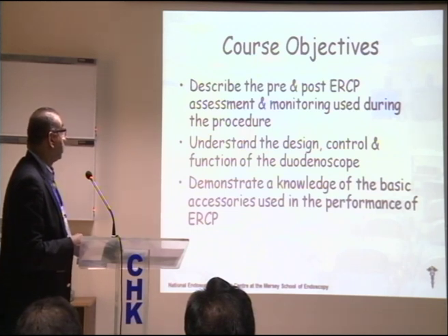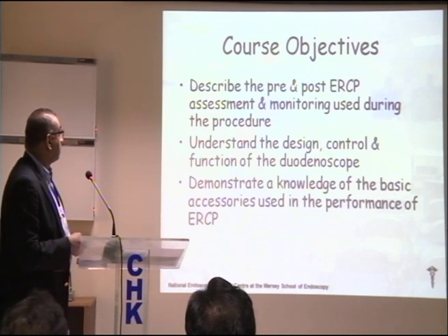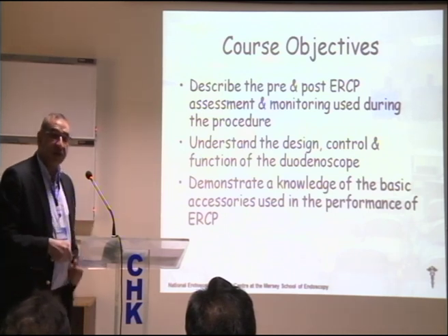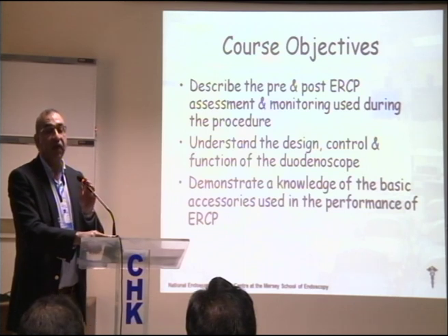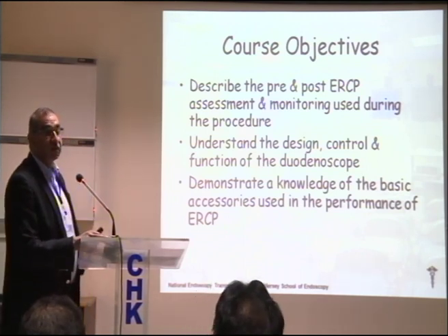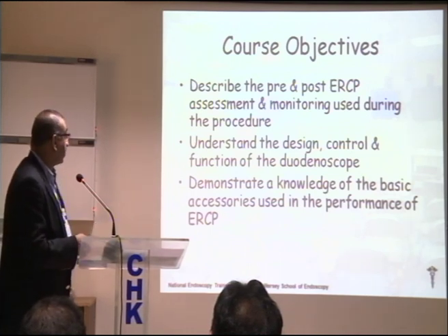So the course objectives are to describe the pre and post ERCP assessment of monitoring used during the procedure, because it is an invasive procedure. Your patient is at risk because of the procedure, because of the sedation that you use, and they have to be properly monitored. You don't just pass the scope and forget about the patient. With the patient, you have to be constantly interactive.